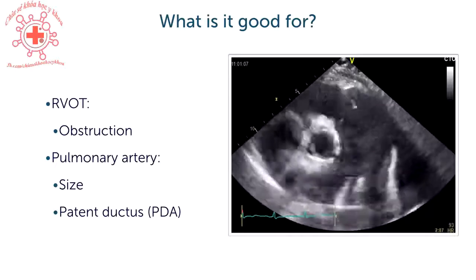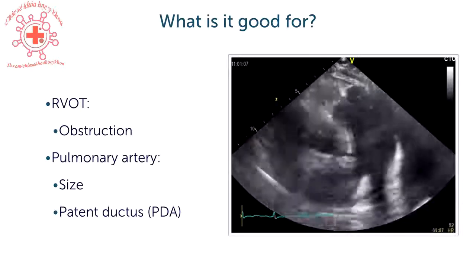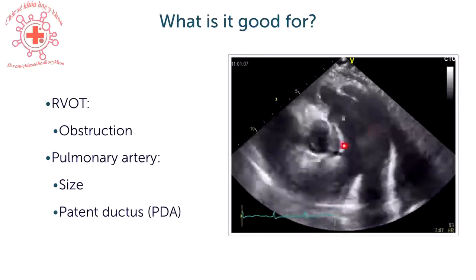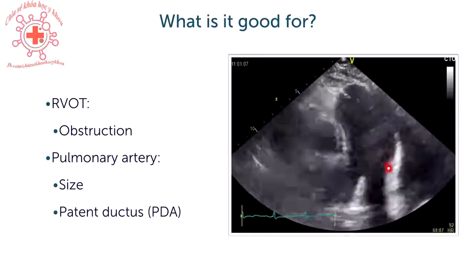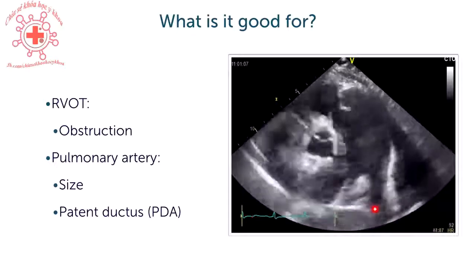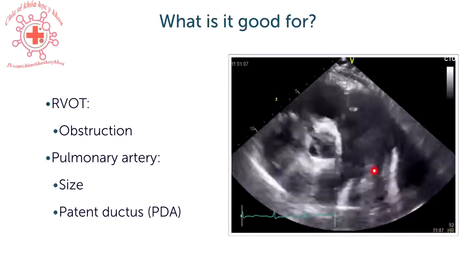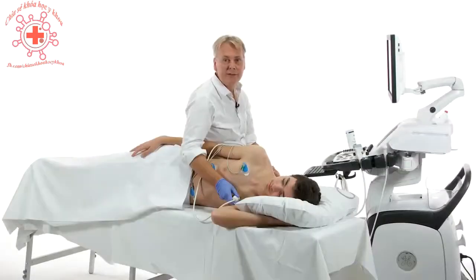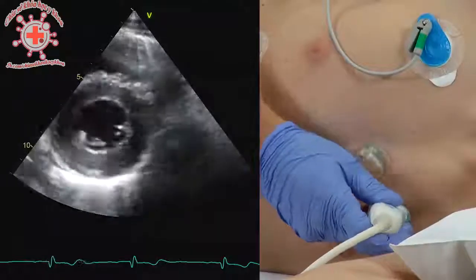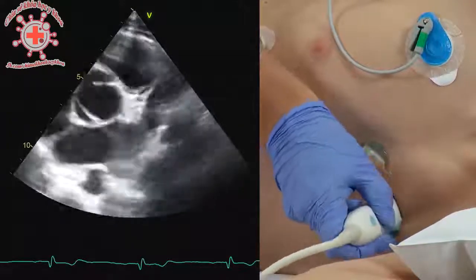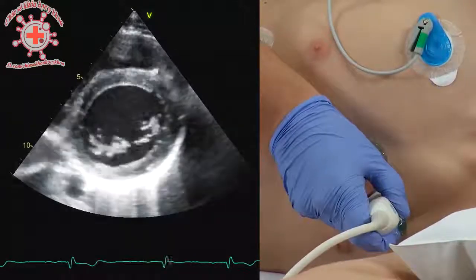You can look at the right ventricular outflow tract to detect obstruction, and also to assess the size of the pulmonic artery. Here's a beautiful example of a patient with a very wide pulmonic artery. Right down here would be the region where you would expect a patent ductus arteriosus, so this view is equally important to detect this form of congenital heart disease. Now let's move on to another short axis view — the short axis view at the level of the mitral valve.